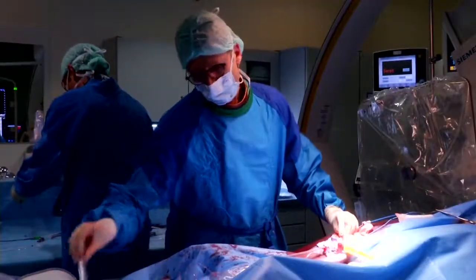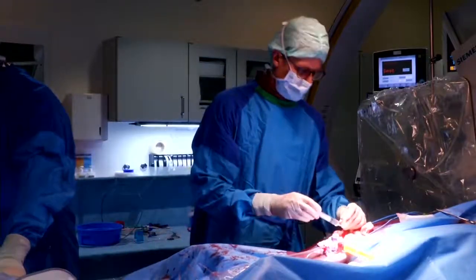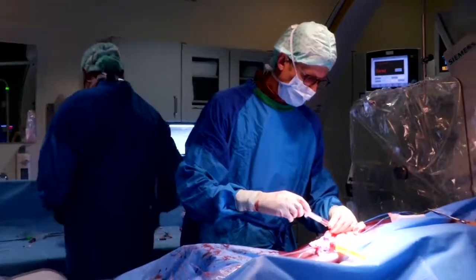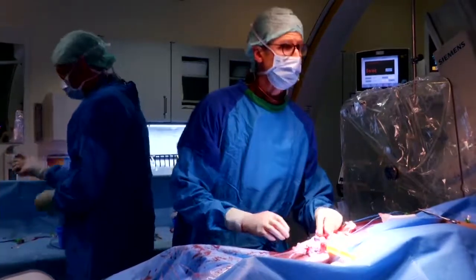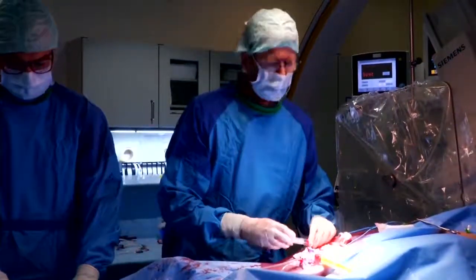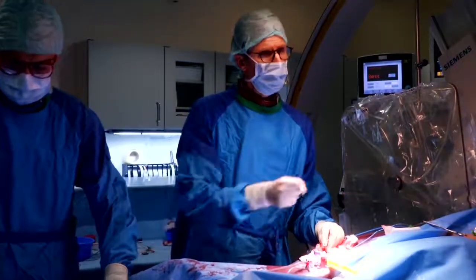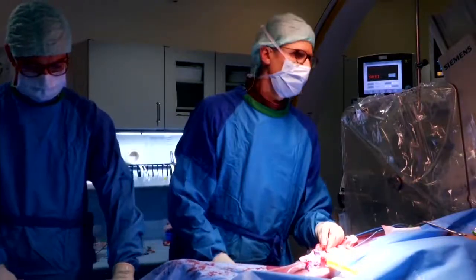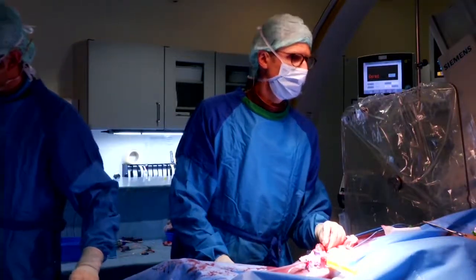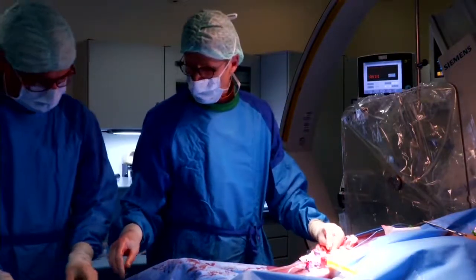Yeah, well, I think you can do it later as well. It's good, but I prefer to have the struts away when I can do it, because there are reports that when you do it afterwards there might be some debris or some intimal ingrowth, and when you then dilate it, these can cause, for example, thromboembolism in the vertebral artery or so. I feel quite comfortable to just dilate it now.